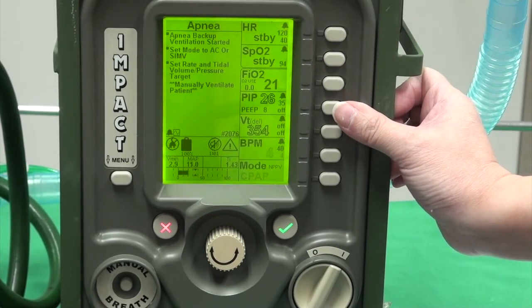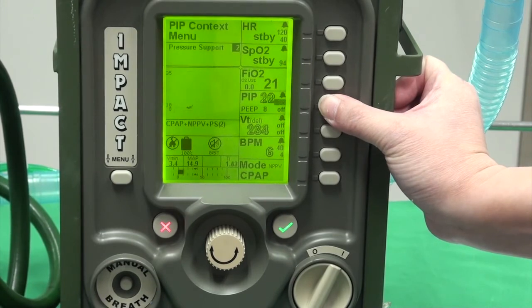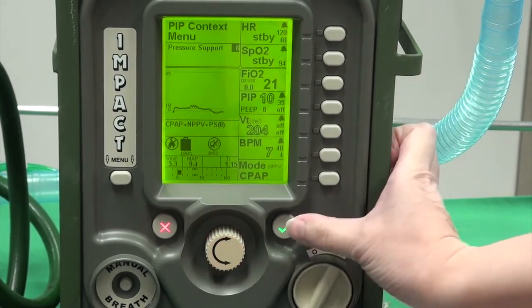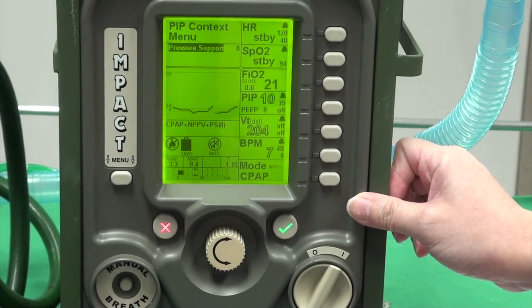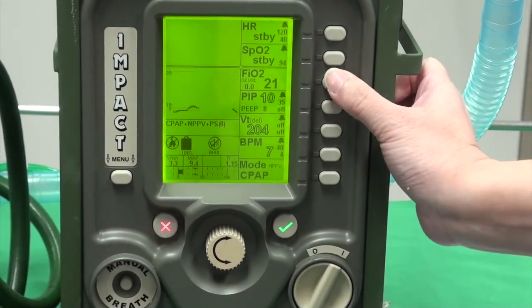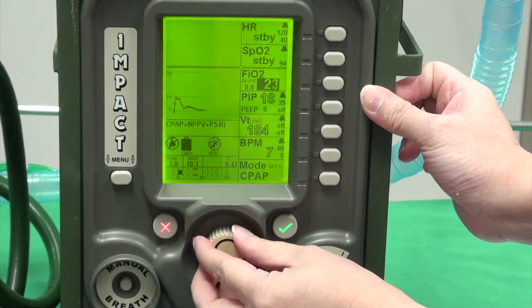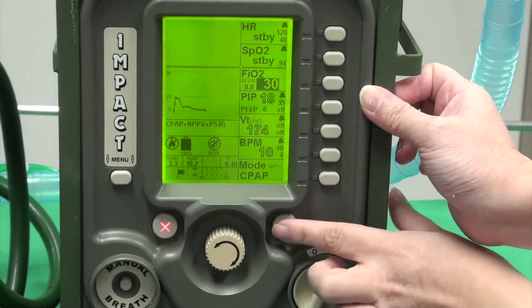To add pressure support, press and hold on the same button and change to the required pressure support that you need. And press to confirm. You can change the FiO2 also by pressing the button next to it and change it up to the amount of FiO2 that you need.